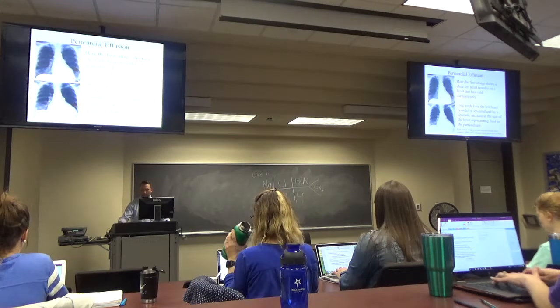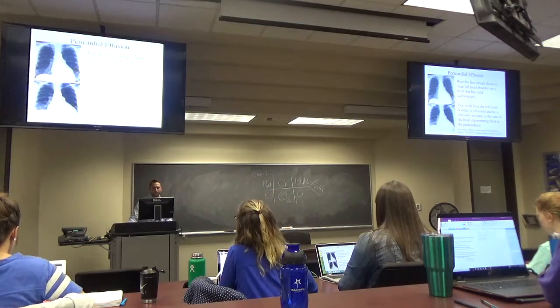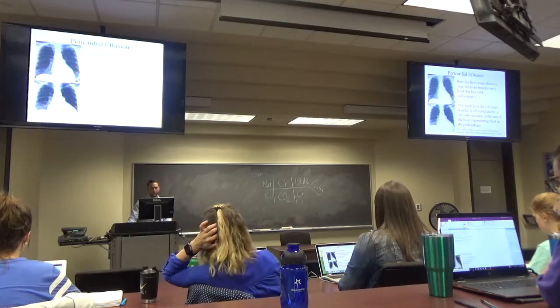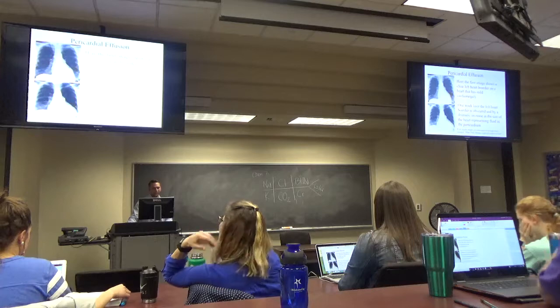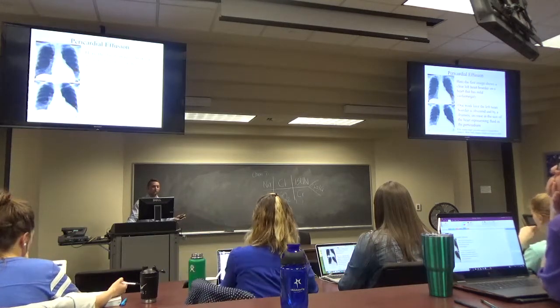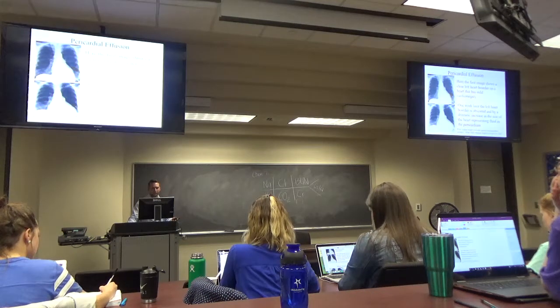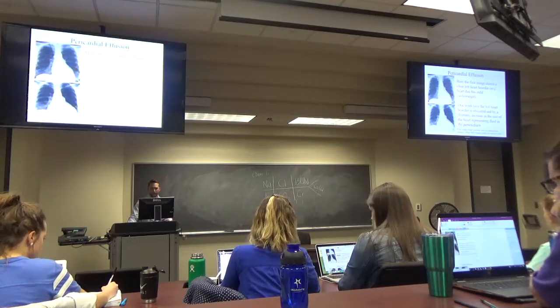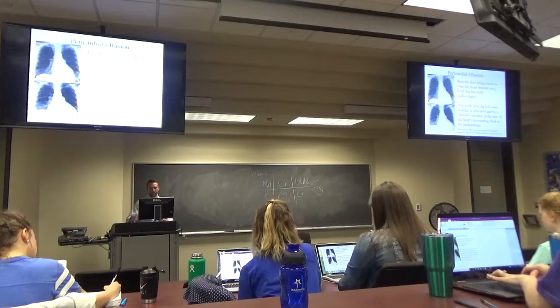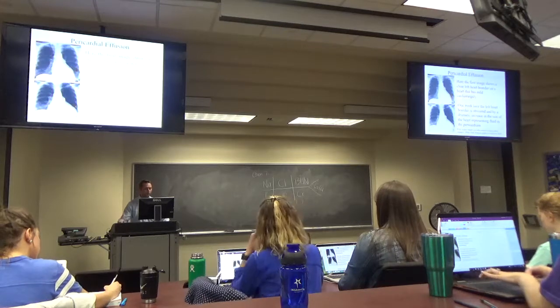So this is an example of a pericardial effusion. This first image is really unremarkable. The heart might be borderline upper limits of normal, but then a week later, it looks kind of enlarged. It looks a little bit different, and these are both PA films, both shot the same way. So in this instance, the size of the heart represents an effusion in the pericardium.